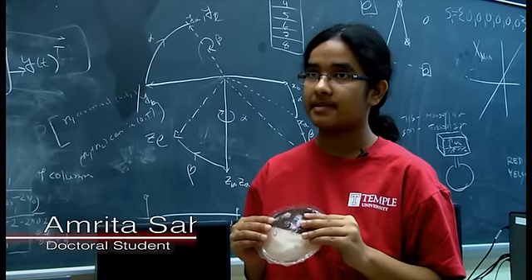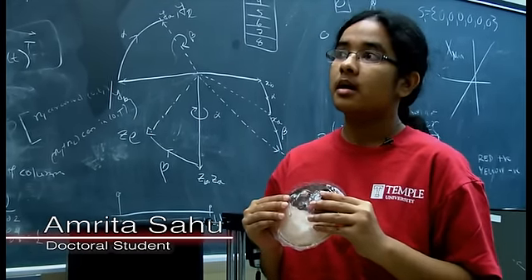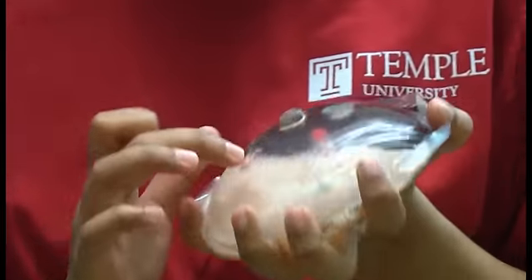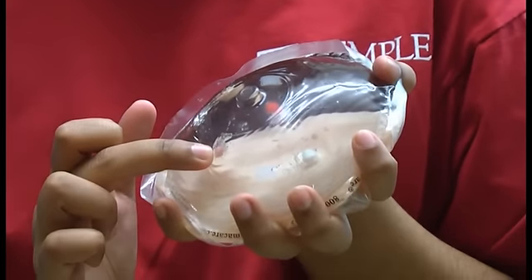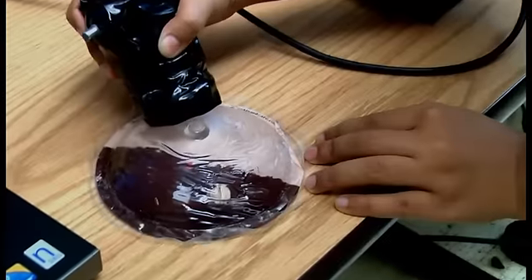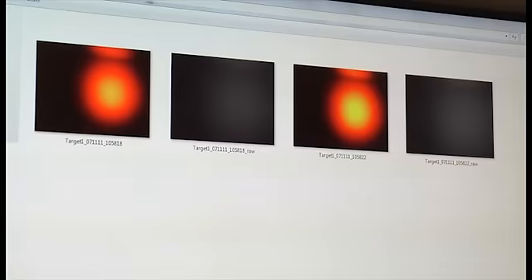This is the Mammacare Phantom. Doctors and nurses use this to learn how to perform clinical breast examination. As you can see in the Phantom, there are inclusions in here. So what we do is that we take the tactile imaging system and we image these inclusions and we save that image onto the computer. After we are done with our imaging process, we now come over to the scoring system.